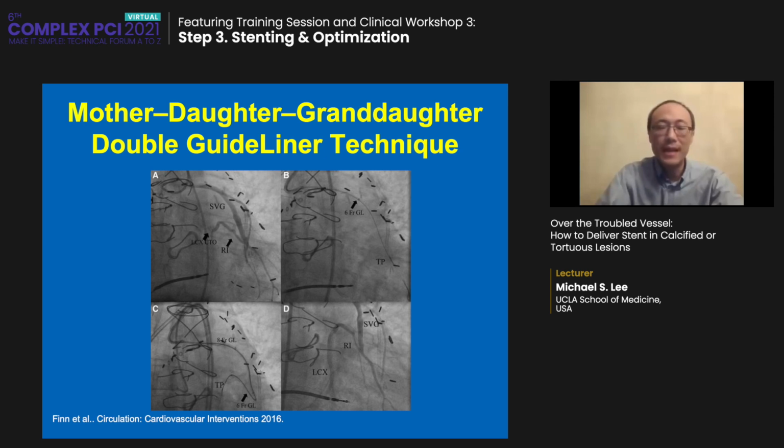This is again another example where the mother, daughter, granddaughter technique was used. So they used a 6 French guide liner inside an 8 French guide liner. There was a chronic total occlusion, and here's your final angiographic result with the use of this technique.